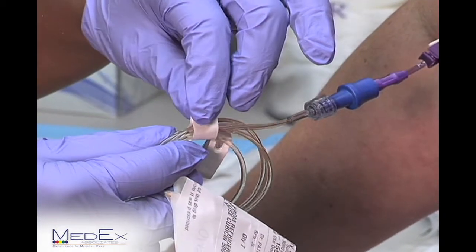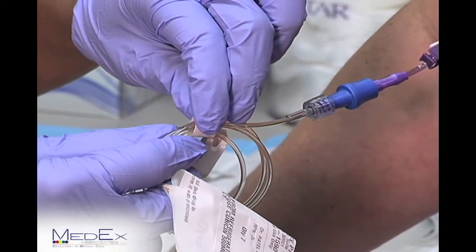Next, you're ready to release the tape on the end. This extends your line to have more working space.